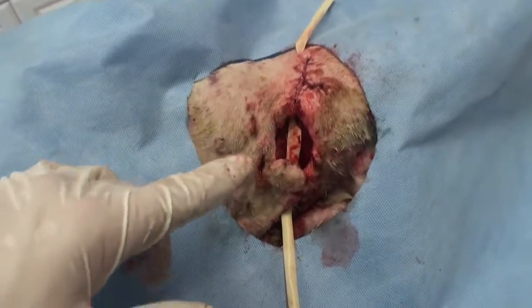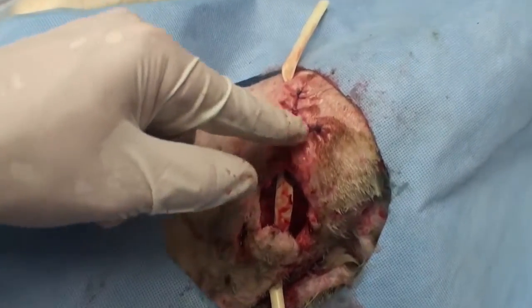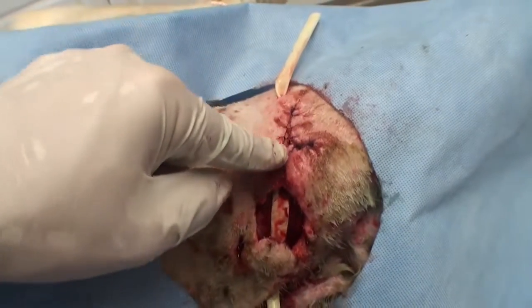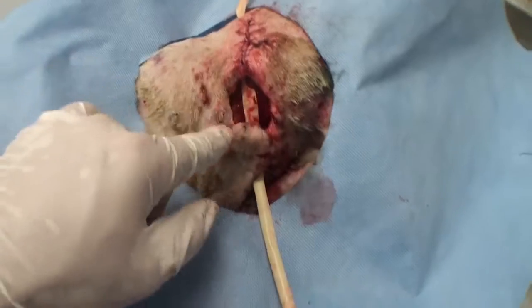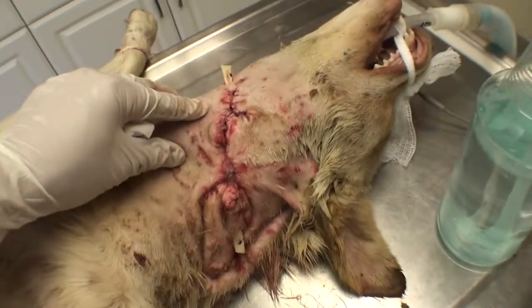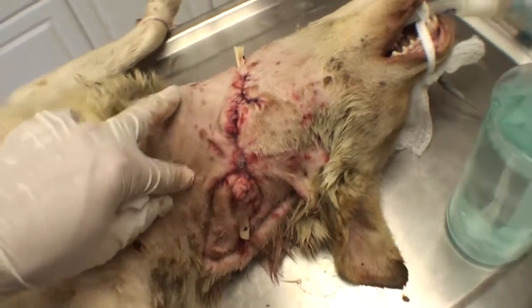So these things are always interesting to try to piece together and figure out where they came from. I have a little piece that I pinched together right there and sutured up, and then I've sutured this part up right here. Now I'm just going to have to figure out how to close this and that little hole there. Not the most beautiful thing in the world, but he didn't give me a whole lot to work with.